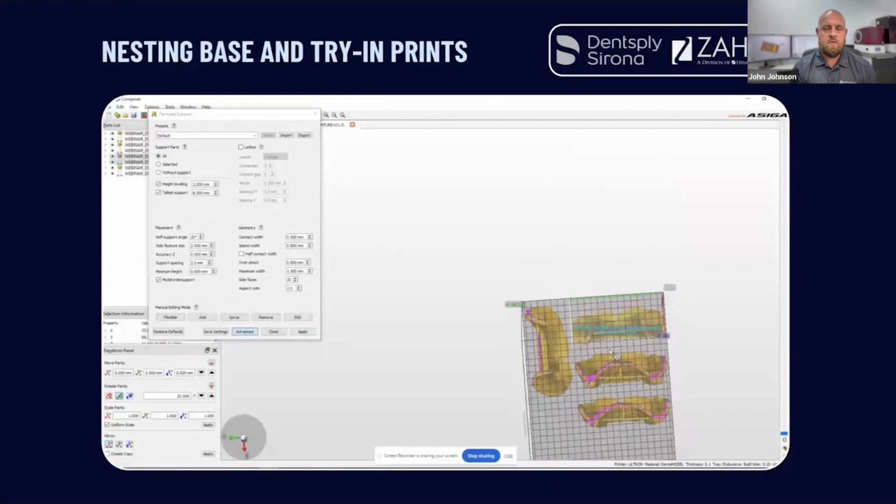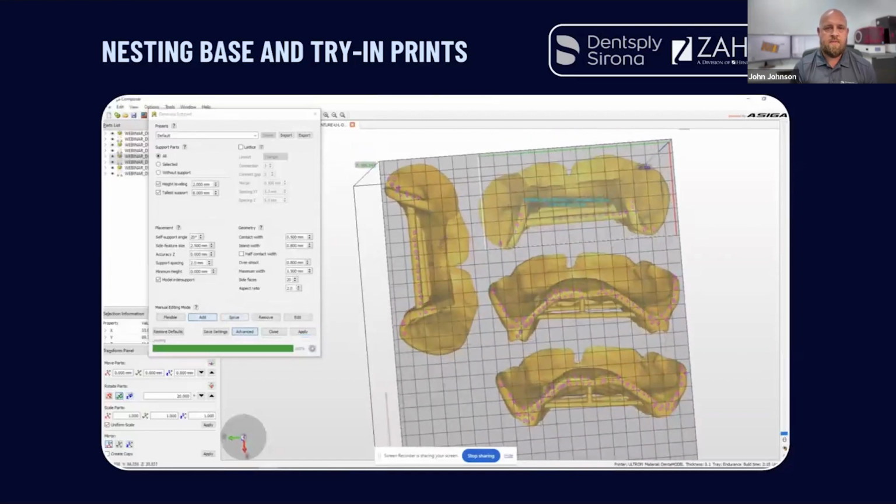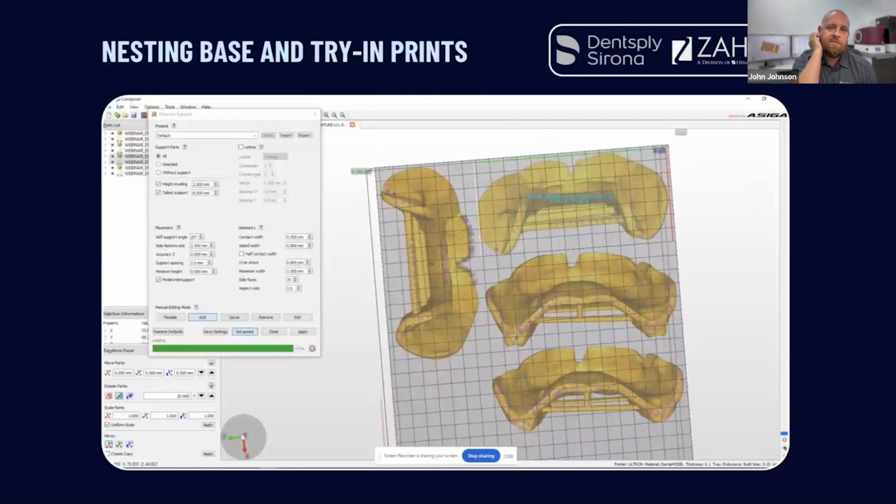And I don't want to do any kind of gingival characterization and then cover it up with a support that I'm eventually going to have to grind off and polish. So I have always printed mine vertically. Now Asiga doesn't have a fencing option like Carbon does, so I kind of create my own fence.